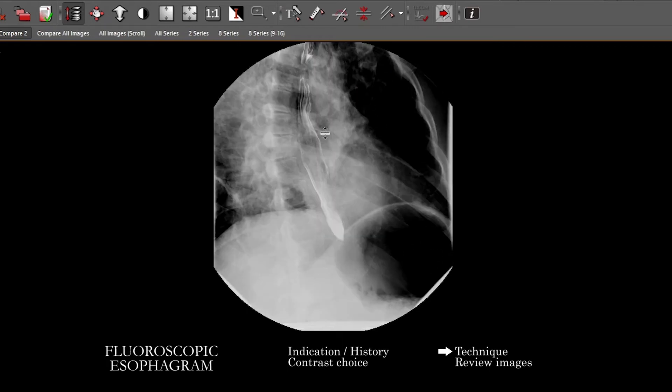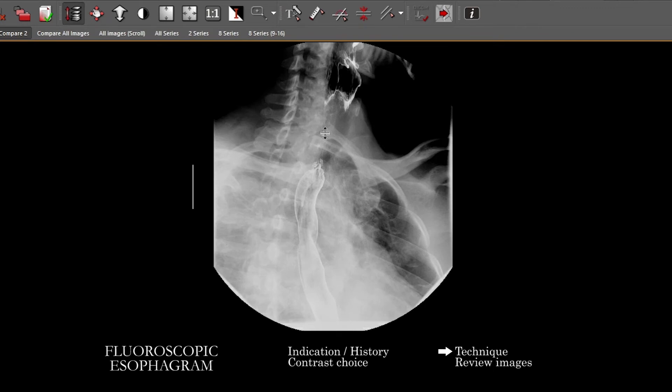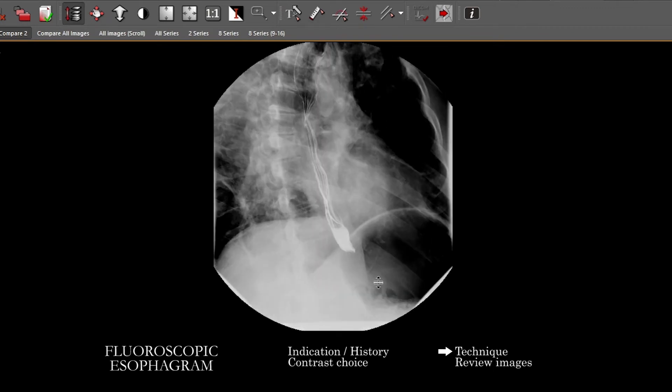In real time, you'll follow the contrast down to the GE junction and watch it pass through to see if there's any holdup or abnormality. You may want to go through and do this not just in an oblique projection, but in a frontal projection for patients who have had prior surgery.